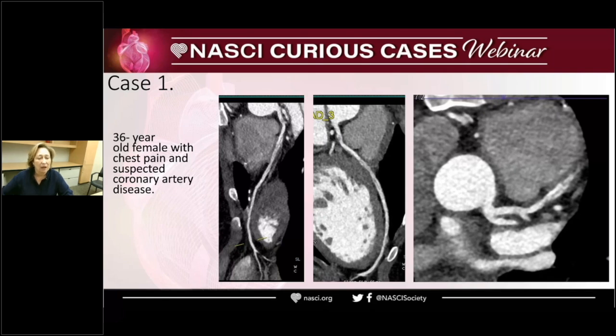So, but if you look closer, and again, I apologize, I cannot rotate it or scroll through, but if you look closer, so this is LAD, left main coronary artery, and then again, that's curved reformats, and that's more or less an axial view that I could create. So you could see that focal area, the small plaque, but there you also see this linear hypodensity in the proximal and mid LAD that extends throughout the artery, and it appears that it looks like a dissection flap, right?